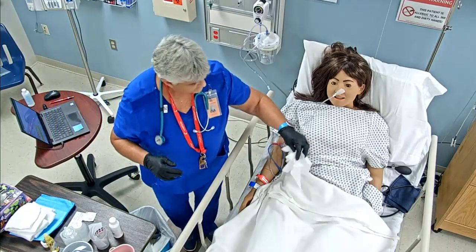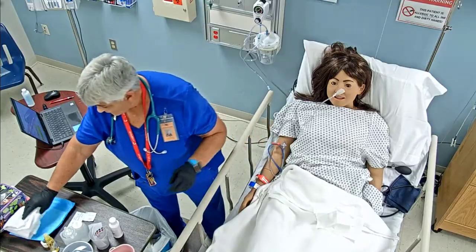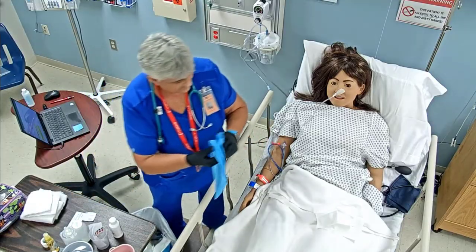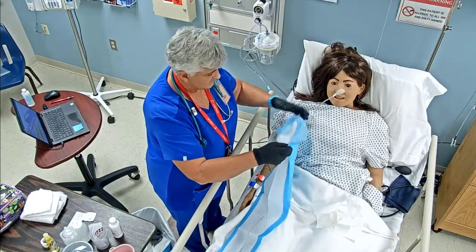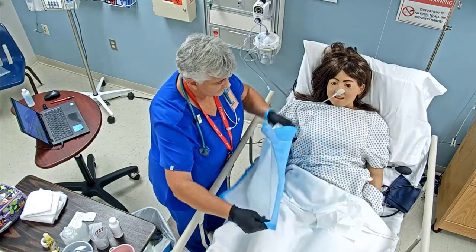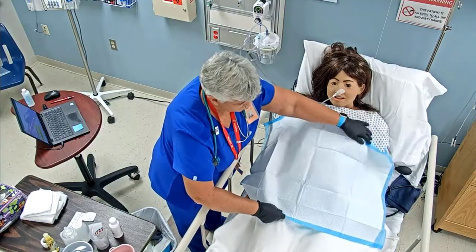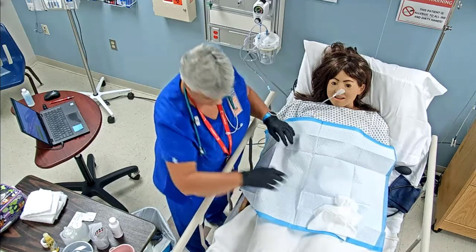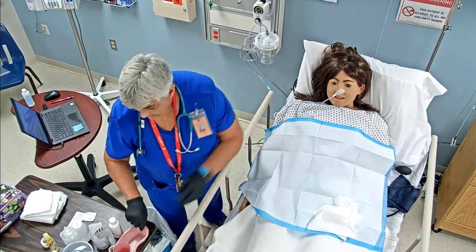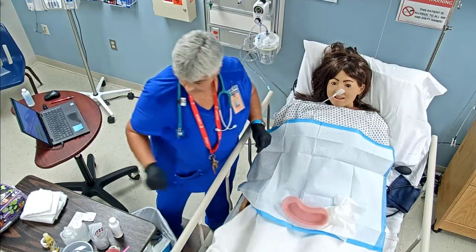Let me give you a couple of tissues, because once we pull that out, you may want to blow your nose. There's your tissue in your hand there, okay? And I've got the Emesis basin here, in case we need that.